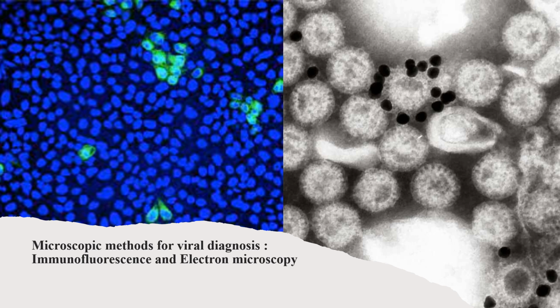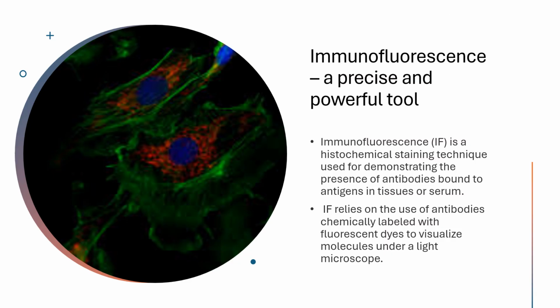Viruses, being incredibly small, often go unseen by the naked eye. Powerful microscopic techniques like immunofluorescence and electron microscopy allow us not only to see these tiny invaders but also to identify them. Modern virology research has become as crucial now as ever before due to the global COVID-19 pandemic.